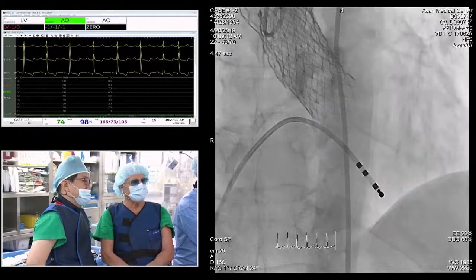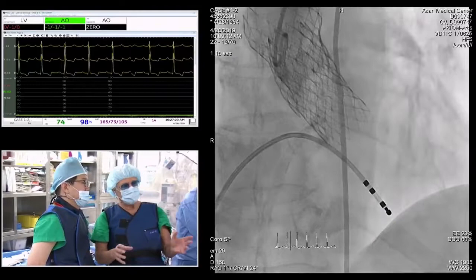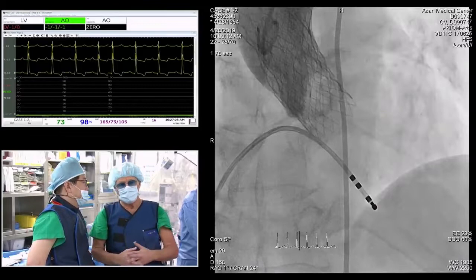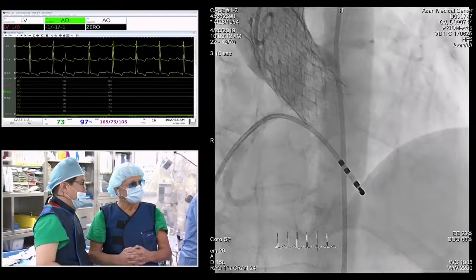We have the same policy, actually. If there's no rhythm concern or no changes in terms of delay or bundle branch block or something like that, we just keep it in until the next day and then take it out. Yeah. For TAVR with the SAPIEN 3, usually we pull out the temporary pacemaker if there is no conduction abnormality on the table, but for the self-expandable device, we keep it for 1 day after the procedure.